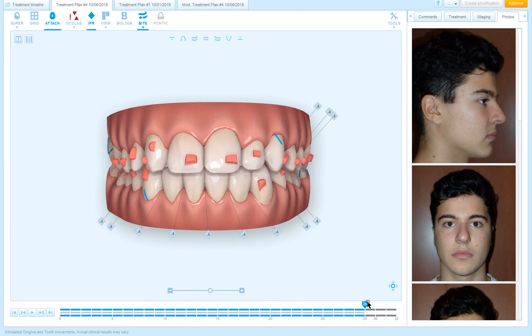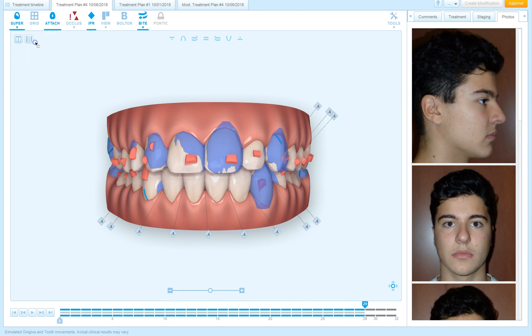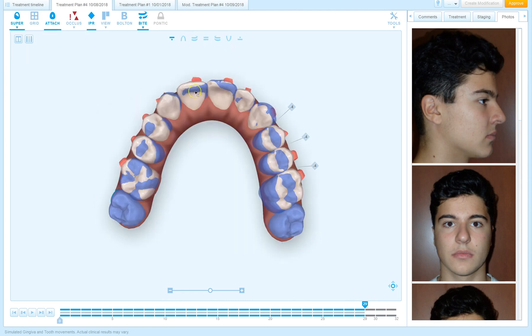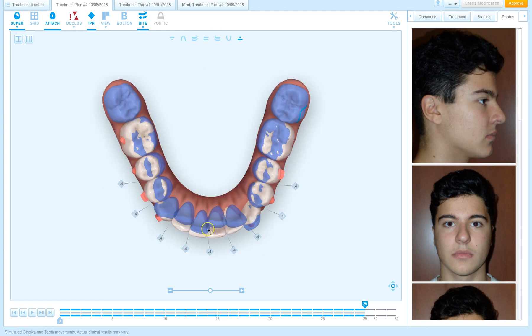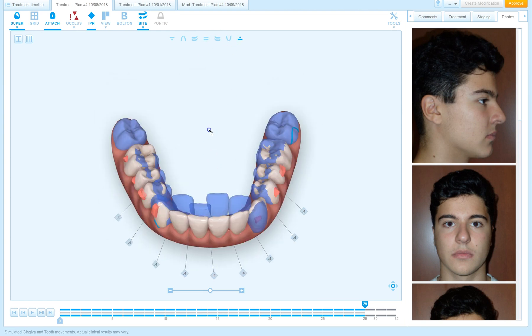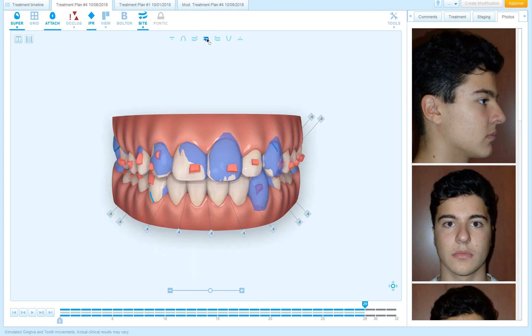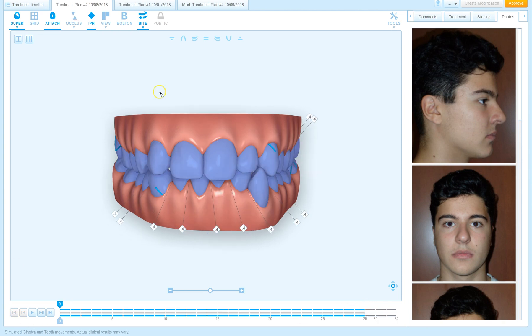So let's look at that in our dental superimposition. If we look at the upper midline, it is now moving over. The lower midline is not moving as much as it was before, and that's my result.